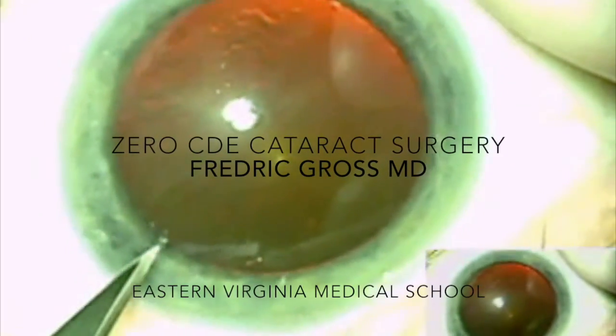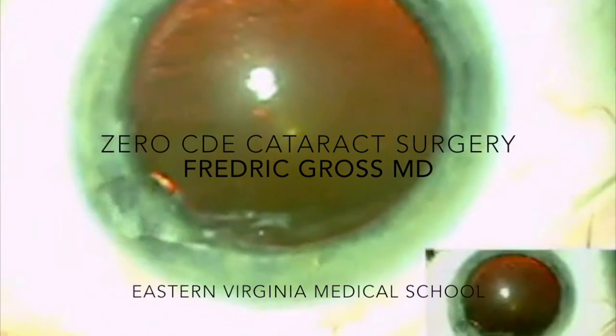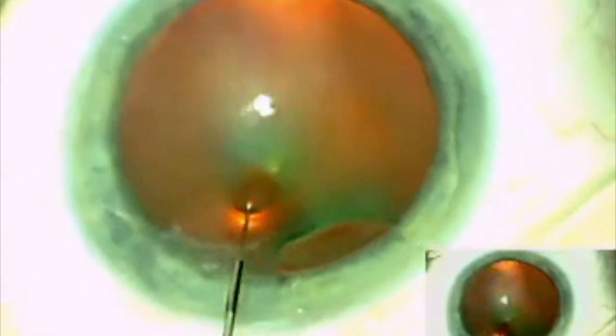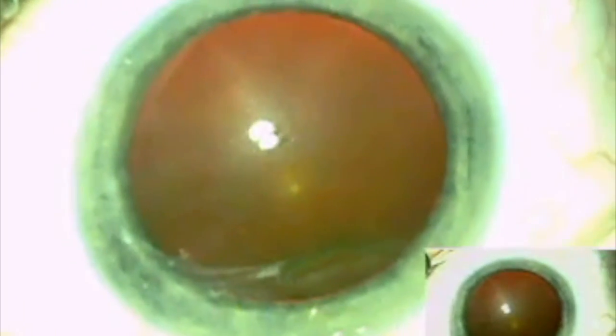In this video, I will present zero CDE cataract surgery using a modified pop and chop technique. The cataract surgery is performed using the Alcon Centurion Vision System.